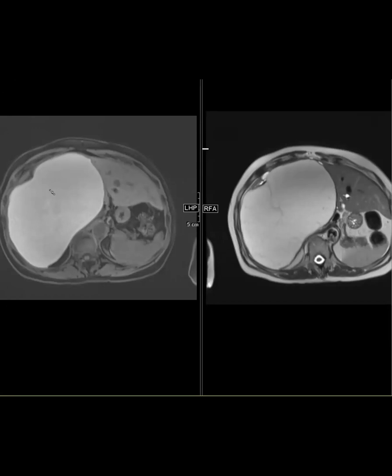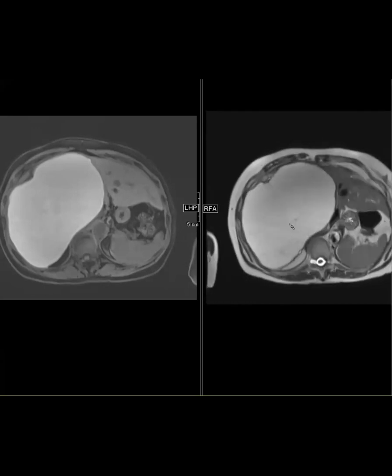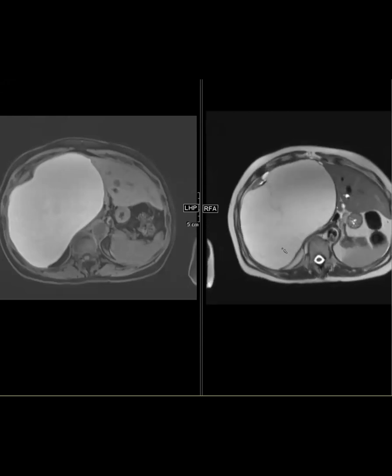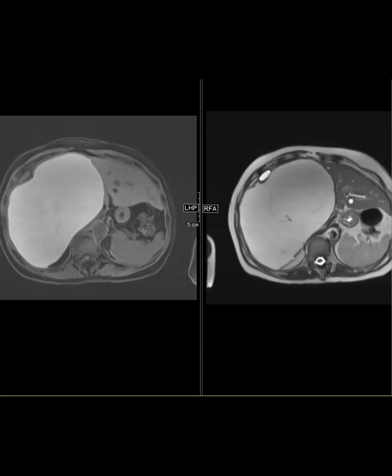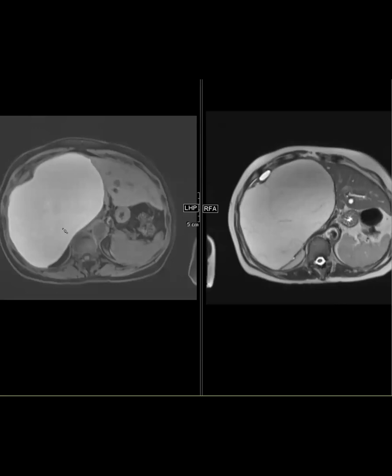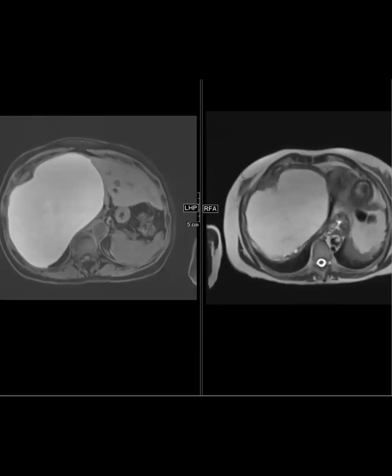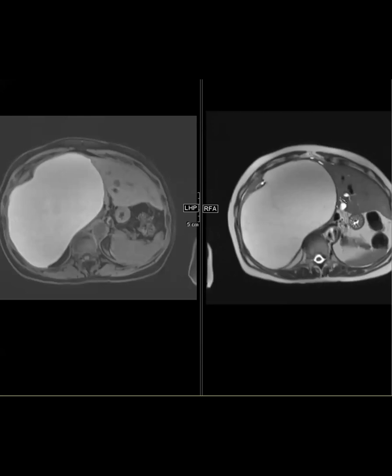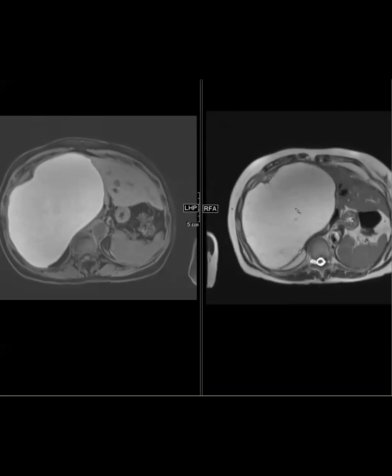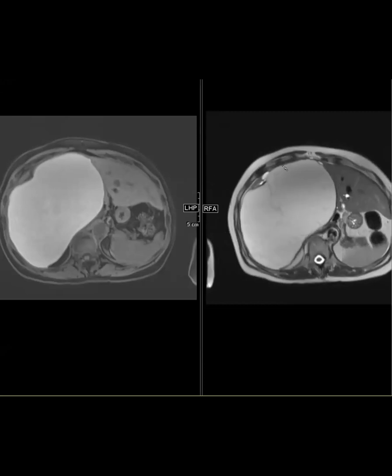When you have these complicated cysts, they can actually have a lot of hemorrhage and T1 hyperintensity in them. And then we didn't think that these were true septa. So I guess the teaching point here is that when you get this complicated cyst, it can have maybe fibrin and things in it, but it doesn't have true septa that are like true walls. So we favored that this was a complicated cyst and it was removed because it was symptomatically pushing on the liver capsule, and this came back as a complicated cyst. So not even a complex cyst because it didn't have any dysplasia on the wall or anything like that. It is a complicated cyst.